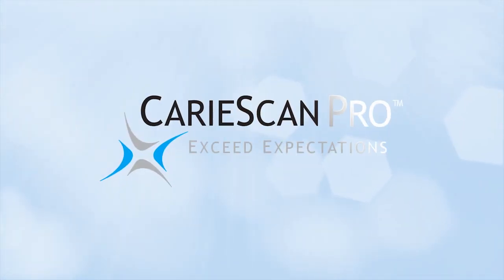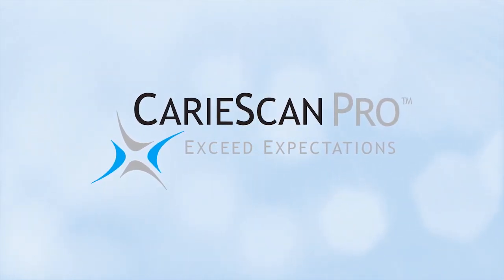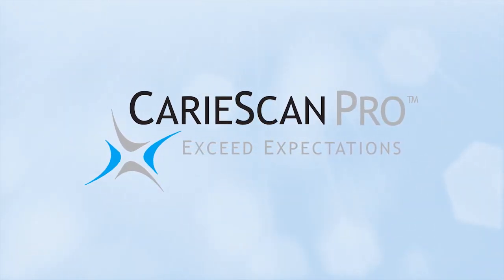CarieScan Pro — the most accurate device for detecting caries with minimal false positives.